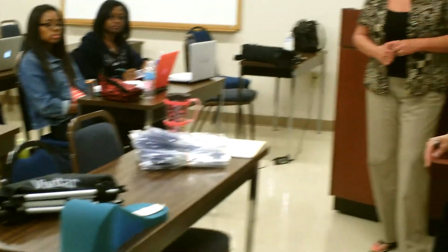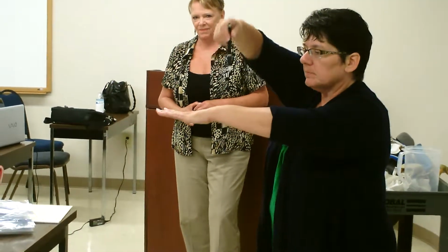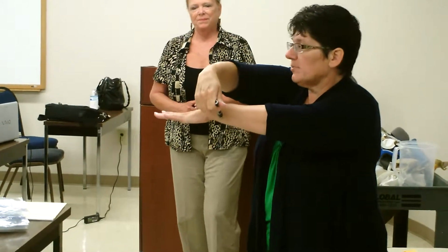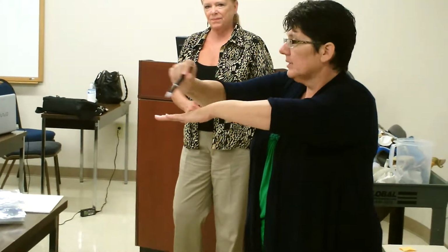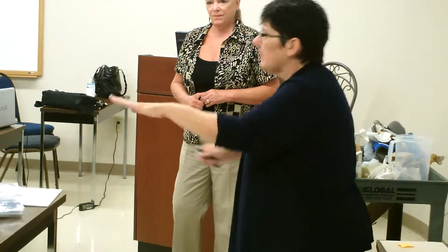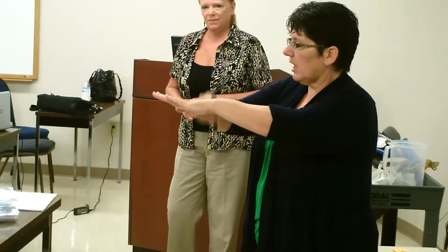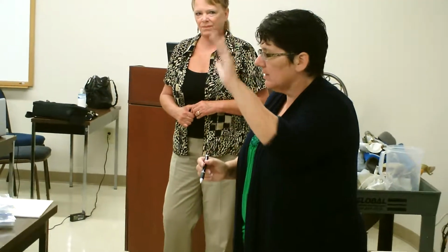The first thing I always do, and I want you to do this with your friend, trace their hand. But when you trace their hand, hold the pen perpendicular. Don't hold it in this way, because the splint will end up too small. Don't hold it that way, the splint will end up too big. Before you lift their hand up, I want you to mark the ulnar styloid, radial styloid, and the distal palmar crease, DPC. I'm going to do it on the board here, Michael.